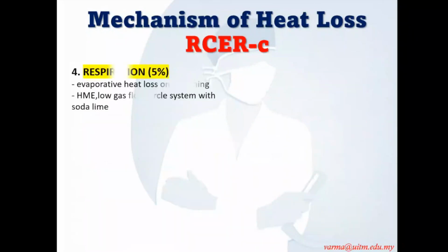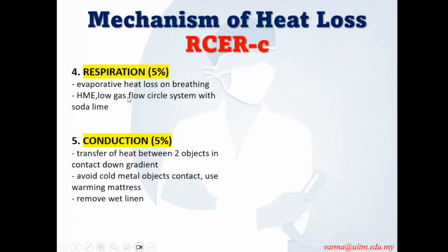So what is respiration? It is evaporative heat loss from breathing. When we breathe, we lose heat through evaporation in our respiratory gases as well. That's why we use an HME, a low gas flow circle system, and soda lime. Soda lime also causes an exothermic reaction. It's a closed circuit.